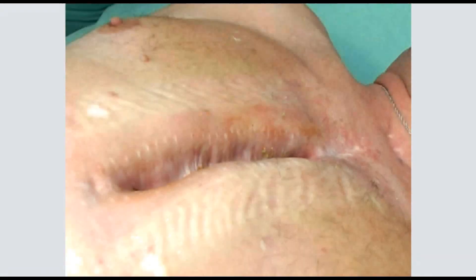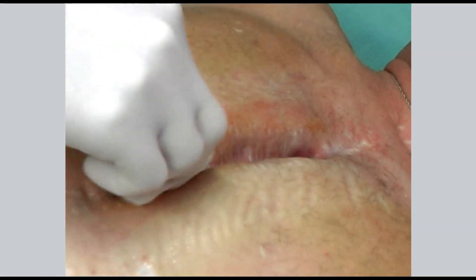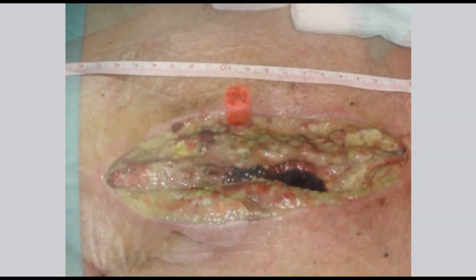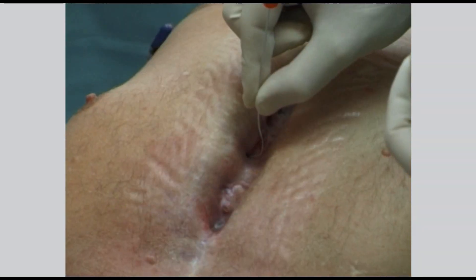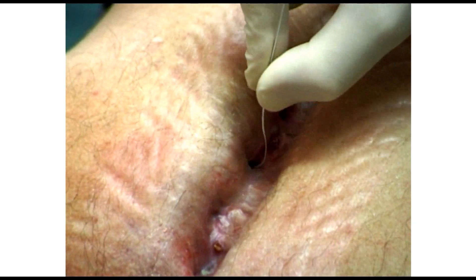The illustration demonstrates the redressing of a wound which occurred after the disintegration of a post-surgical wound and the subsequent breastbone necrosis following a cardio-surgical operation. The original wound can be seen in the photograph. At this moment, the wound is almost healed and there are only two small fistulas left.